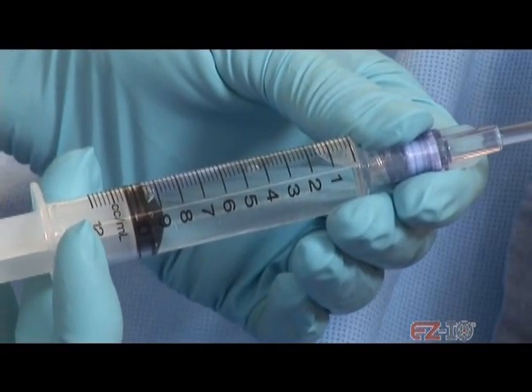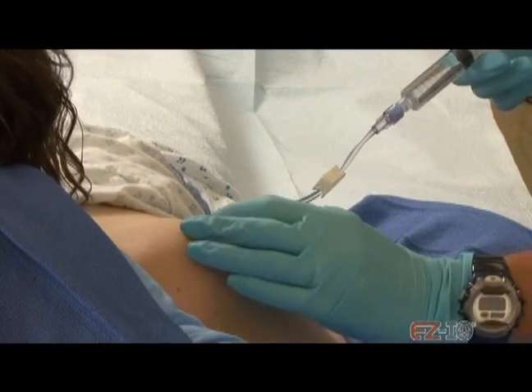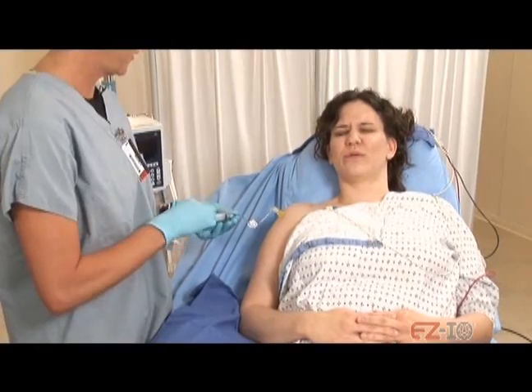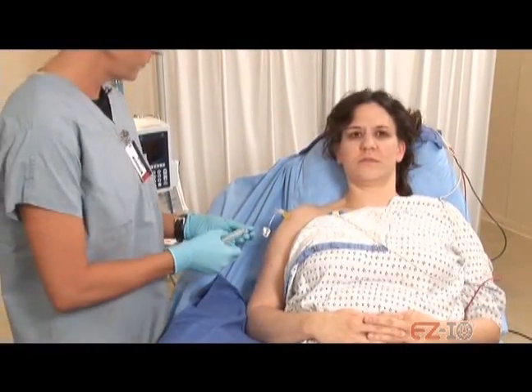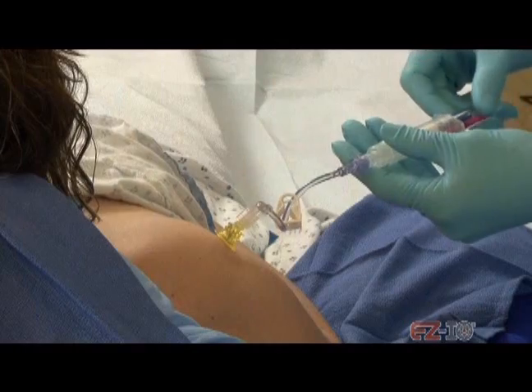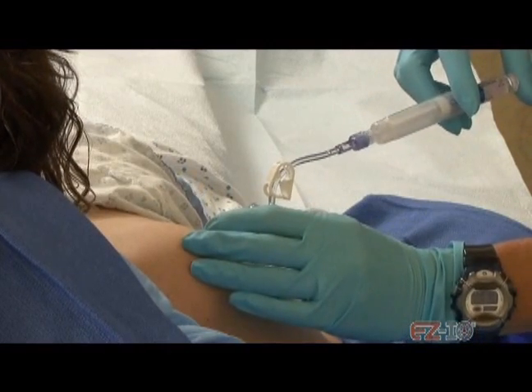If the patient is alert or responsive to pain, prepare them for intense pressure associated with the bolus. So the rest of this, it's going to have to go in pretty quickly. It's going to take me about 5 seconds to get that in, so I'm just going to count you through it, okay? Are you ready? Administer 10 milliliters of normal saline very rapidly over 5 seconds or less. Doing all right? Note that the pain will end almost immediately after termination of the flush. Flush is required to get good flow. Remember, no flush, no flow. You should then follow with additional lidocaine as protocol allows.